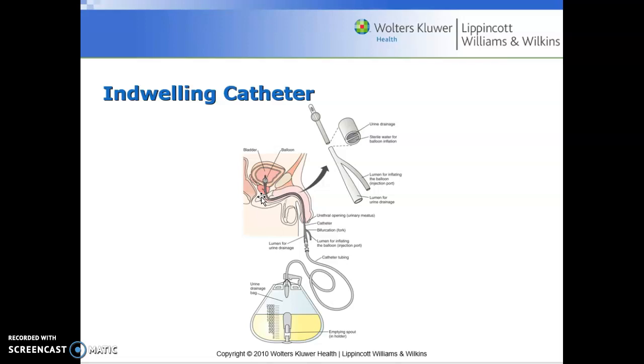If the doctor has ordered a 30 ml balloon, maybe this patient has had a Foley catheter for a while and things are stretched out and not like they should be. If it calls for a 30 ml balloon and you put in 10, then you run the risk of that patient pulling that catheter out and traumatizing their urethra. The purpose of inflating that balloon is to hold the catheter at the base of the bladder, and we don't want to forget to deflate that balloon before we remove that catheter. So when you're checking off, please make sure to be careful with that.